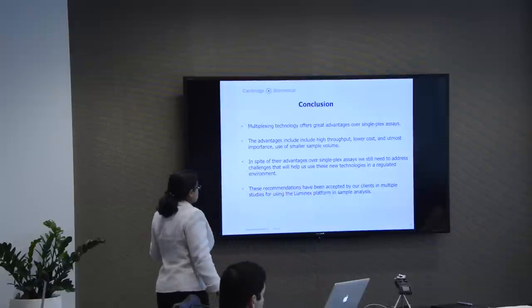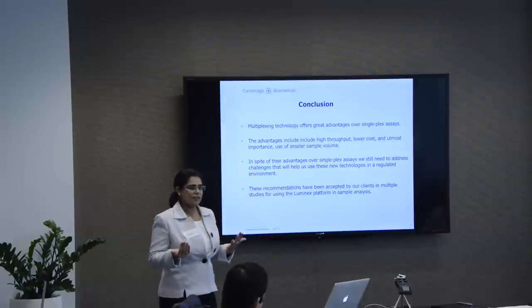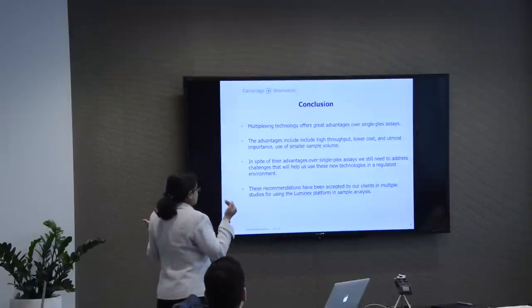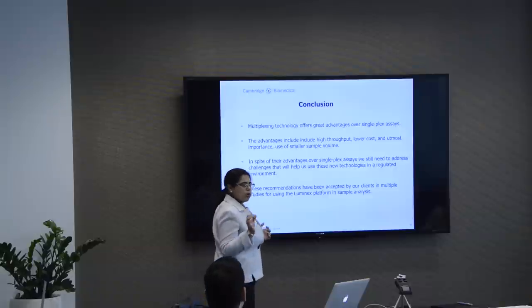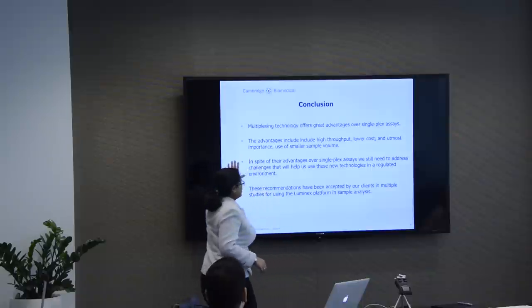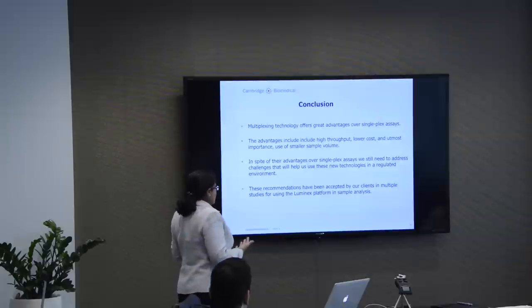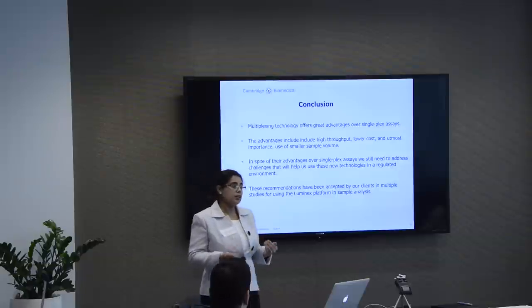So what are we going to conclude? Multiplexing is a great technology. We love it. The advantages are high throughput, lower cost, and most importantly, use of smaller sample volumes. We need that. But in spite of their advantages over single-plex, we still need to address these challenges, because we have to use them in a regulated environment.